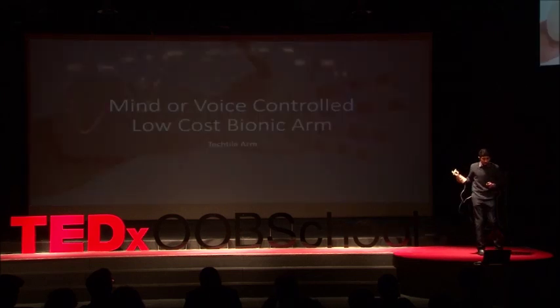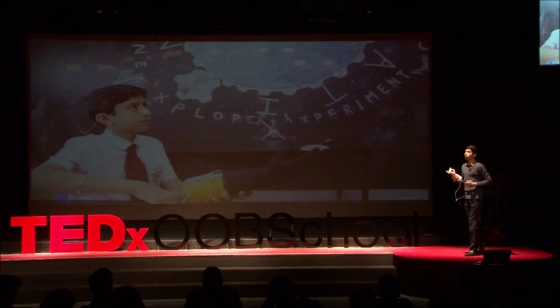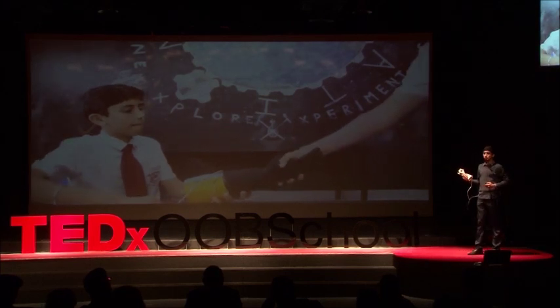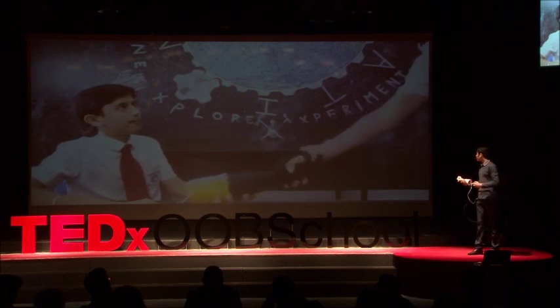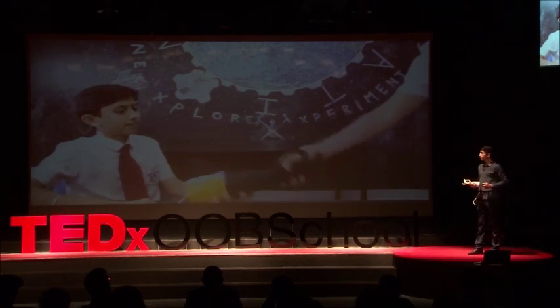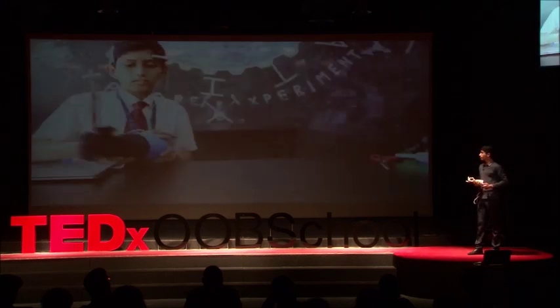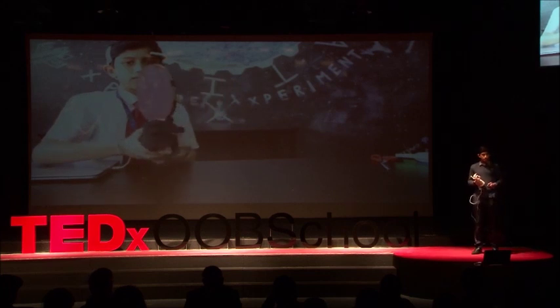Now this is a short video of me showing you all the different things that the hand can do, the mind-controlled version. It can achieve all activities of daily living, such as shaking hands, picking up objects, or even playing sports. And that, by the way, is the headset with the wires coming out from it to the hand.